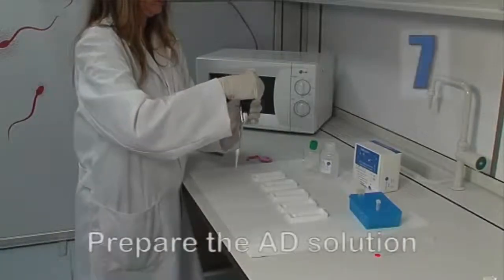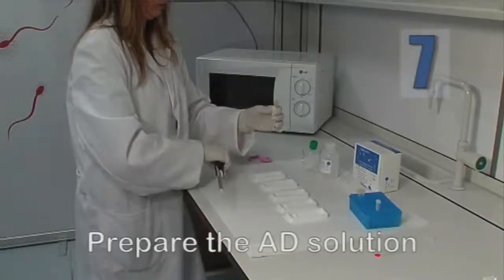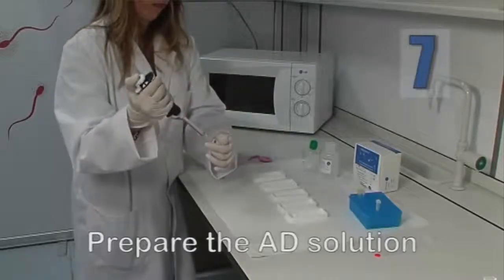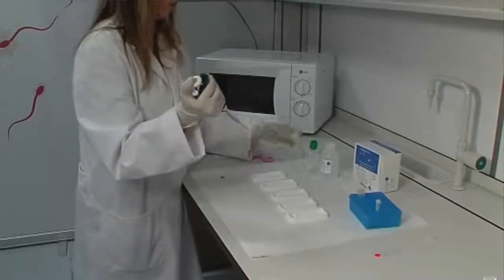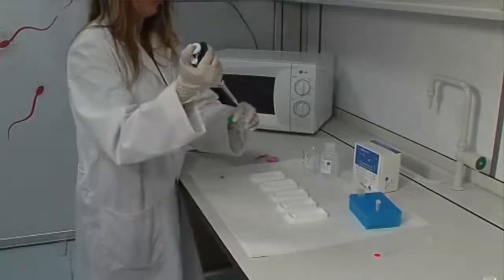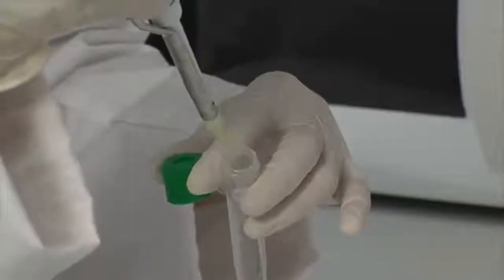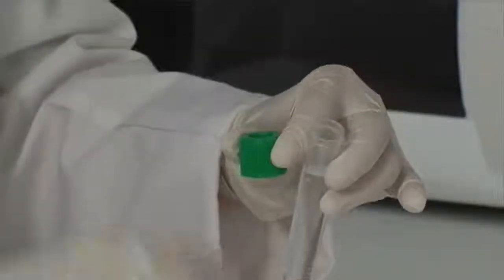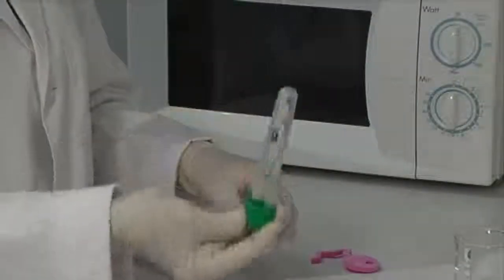While the agarose is setting, prepare the denaturing solution AD by adding 80 microliters of the AD solution to 10 milliliters of distilled water. As its name suggests, the denaturing solution separates the DNA strands.